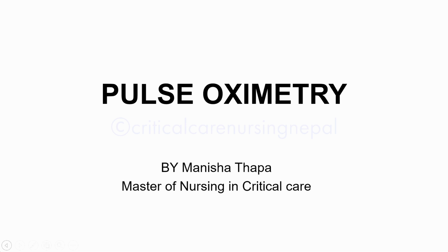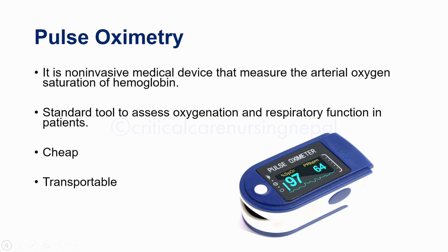Now let's begin. Pulse oximetry estimates arterial oxygen saturation without drawing blood. It has become the fifth vital sign, but in critical care, we know it's not infallible. It is inexpensive, portable, and continuous, which is why we use it on almost every patient, especially in the ICU. But as you will see, the device makes assumptions, and when those assumptions break, so does your data.